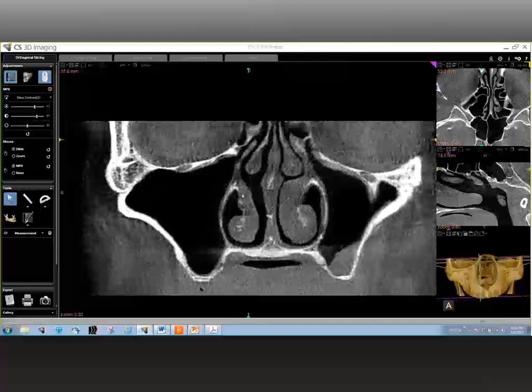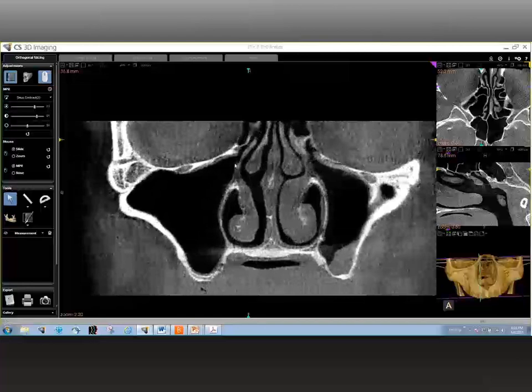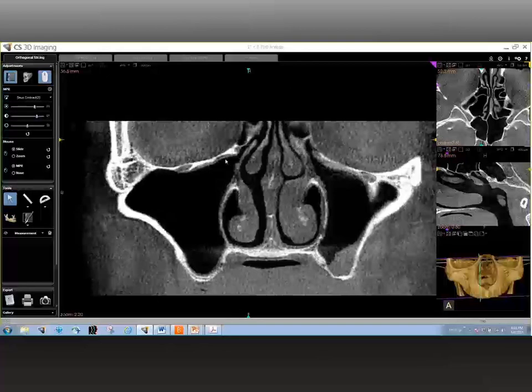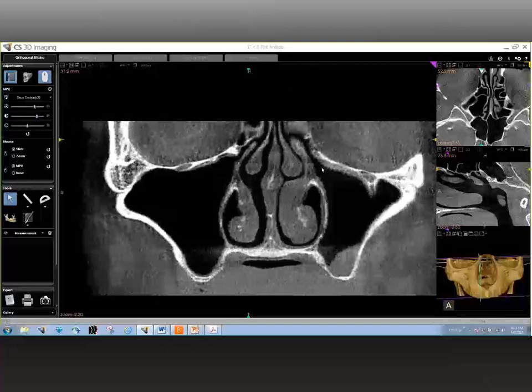Besides those structures, if you look carefully, it also demonstrates a very important structure called the ostium. The ostium can be bilaterally visualized, and you can see it extending all the way from the sinus into the nasal cavity. Keep in mind, the nasal cavity can also be visualized in the maxillary sinus, so it may be important to keep an eye on any kind of disease that could happen within the nasal cavity.